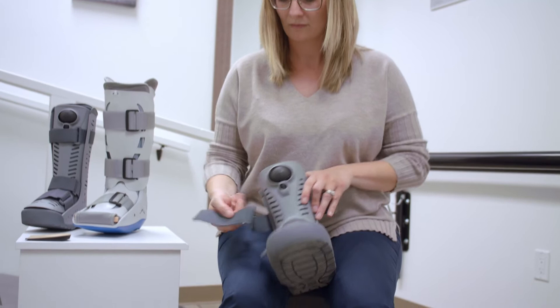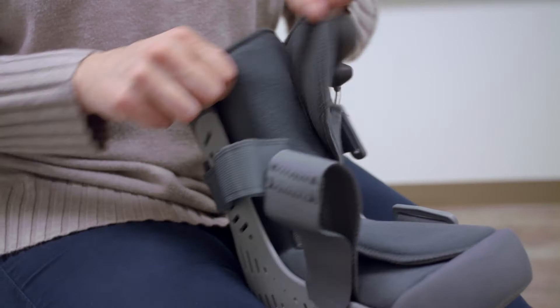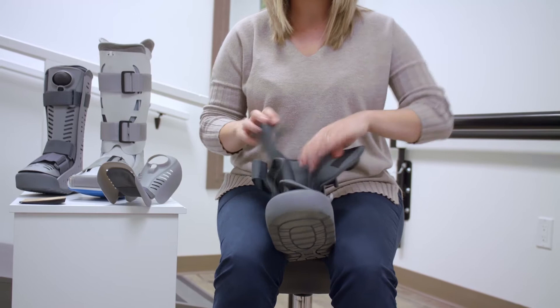So you take it apart. I like to stick the Velcro onto itself so it doesn't stick on everything like clothes. Take this off and open it up. Make sure all the air is out of it before you put it on.